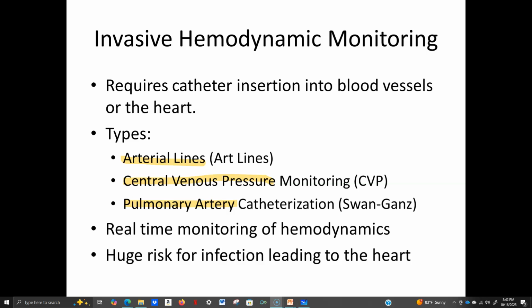I know that normal saline or heparinized saline, although I have not seen that used in forever. I know we will use normal saline, and technically that is a medication. But that's about it as far as medications that I would want to see go through an art line.